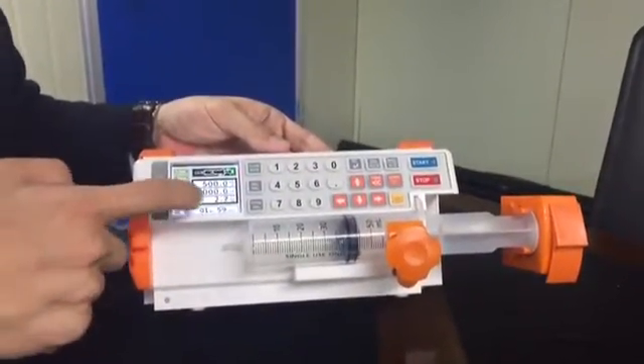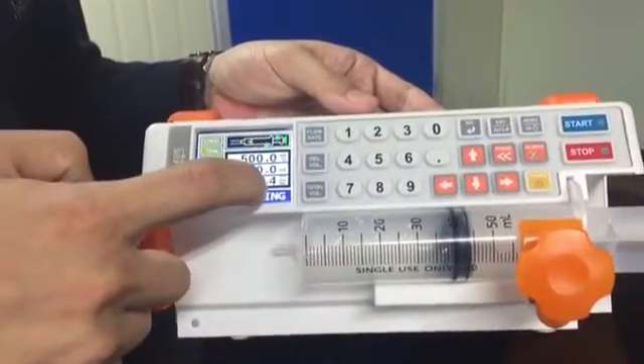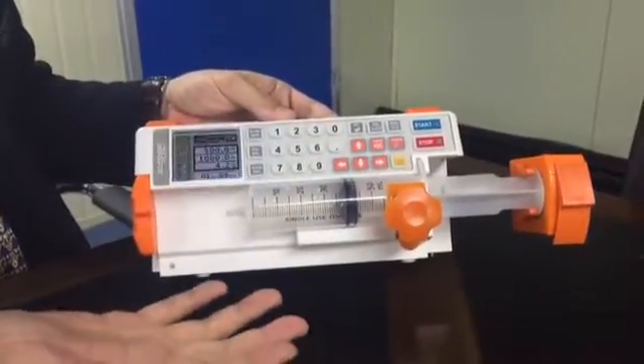And this means you have already infused 3.3 milliliters. That's how it works — that's how to use this machine.